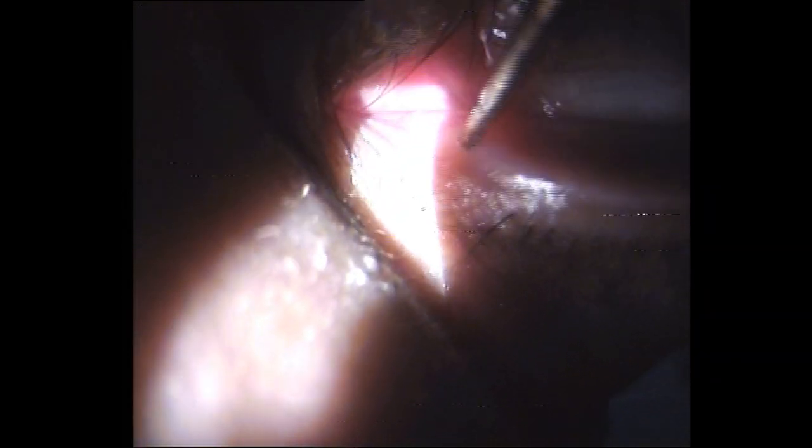So our next step is to go and do a punctum dilation with a punctum dilator. A Nettleship dilator is usually used. The important thing is you have to be very gradual with this. Do not push it. I've seen people pushing it, and that tends to cause the sphincter of the punctum to get ruptured, and then they tend to have a very large opening of the canaliculus. So it needs to be very gentle.